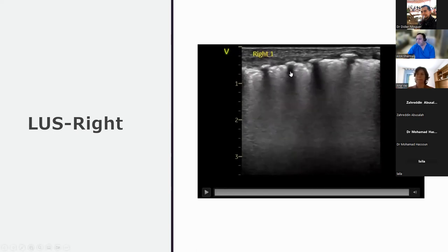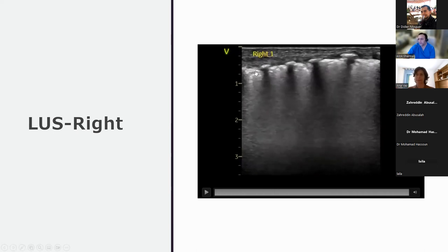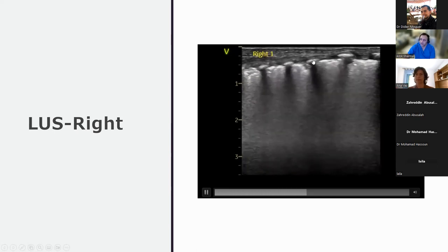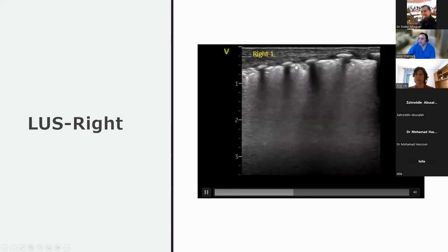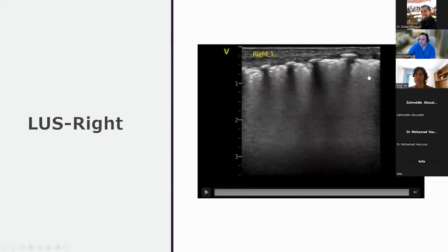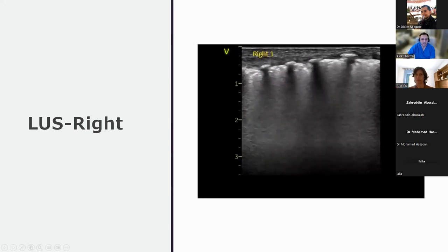Okay. But if you were to say evolving lung disease in a baby, where the pleura is irregular, there's definite. So if I just go in order, I've basically got the bat wing sign with the ribs. I then have pleura in between that's very irregular, doesn't have a regular margin, with a lot of subpleural consolidation that you can see. It's very dense towards this part of the screen. So I'm just going to show you.